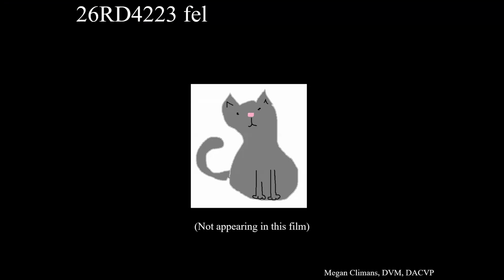Okay, I've got two more cases for you. This first one doesn't have a gross photo, as you can see. So this is a 13-year-old spayed female Norwegian forest cat. The eye that we got had conjunctival hyperemia and episcleral injection, chemosis, segmental posterior synechia, a mydriatic pupil that was minimally responsive to light, and complete bullous retinal detachment, and blindness. The patient is also FIV positive, has a history of diarrhea, decreased appetite, and weight loss. So not doing well systemically, potentially.